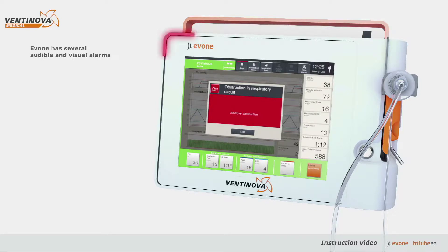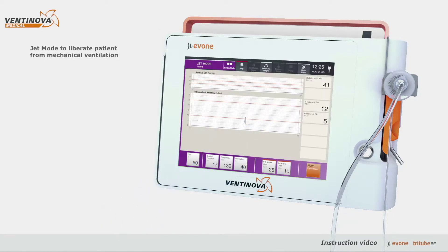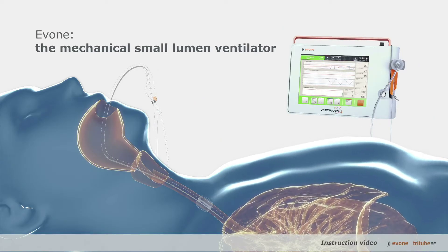Yvonne indicates when a physician's action is required. Yvonne has a jet mode to wean a patient from mechanical ventilation to spontaneous breathing using traditional subglottic high-frequency jet ventilation. Thank you for getting acquainted with Yvonne, the mechanical small lumen ventilator.